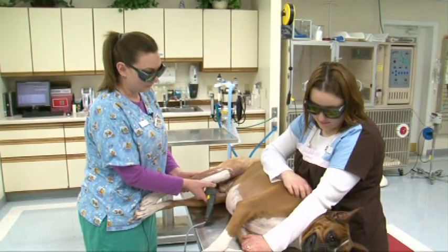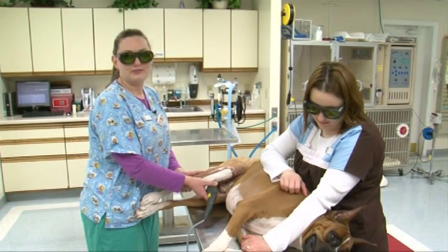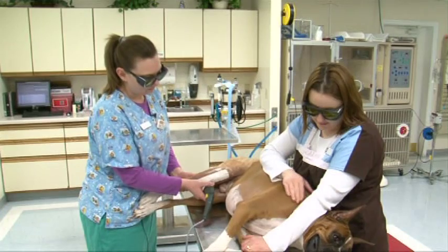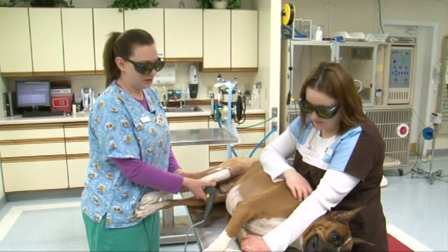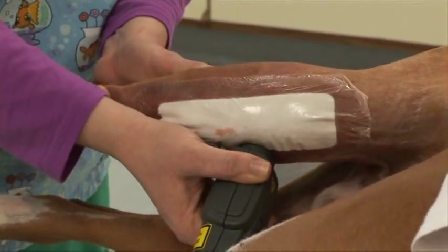I was very skeptical because how can a little probe make somebody feel better just by touching their skin. But now after seeing the patients after their treatments and seeing how much improvement they've had, and the owner telling me how much improvement they've had, I actually am a believer now.